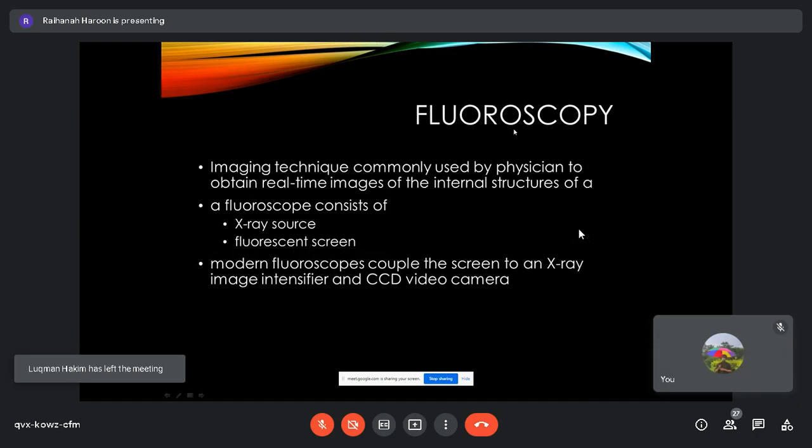The difference between fluoroscopy and X-ray: both use radiation, but X-ray basically uses a static, 2D image. Whereas in fluoroscopy, we are doing a kind of cinematography, cine, which is a video function, because we want to see how things move in real time.